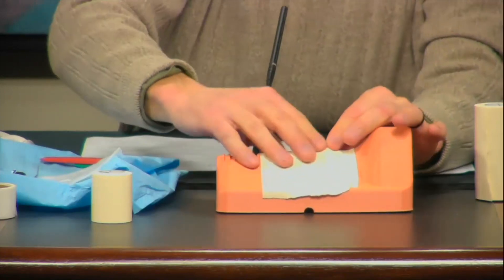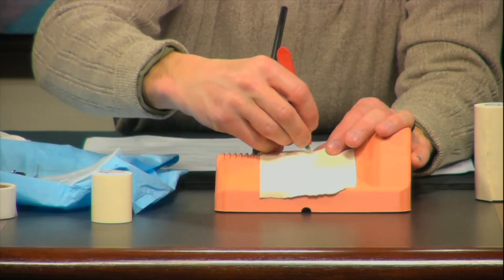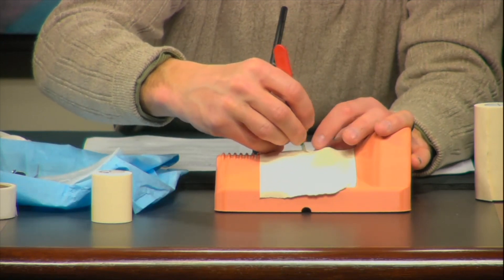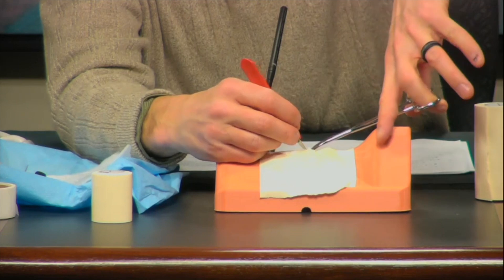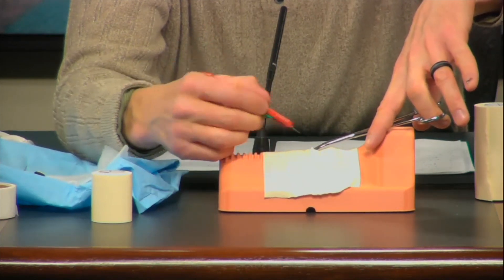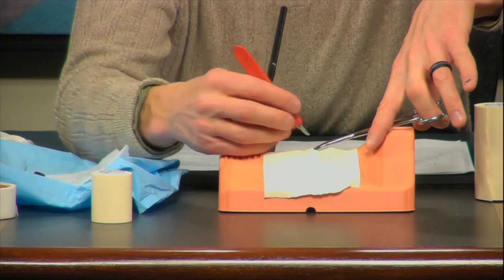Identify your landmarks and you're ready to make your incisions. We'll carefully cut through the first layer that mimics the skin. Now we can see there's a space between the skin layer and the membrane layer with this trainer, allowing you to see the two different layers as you work through the procedure.